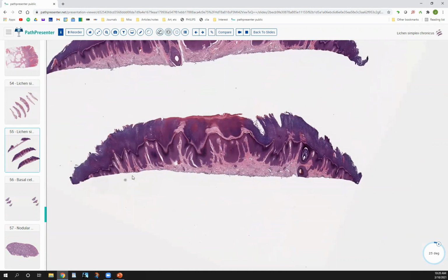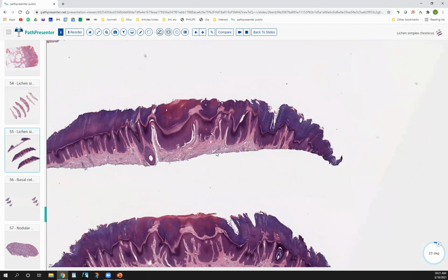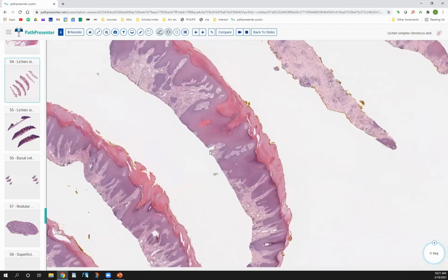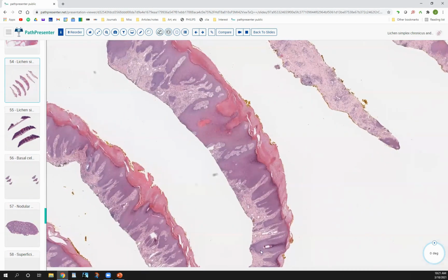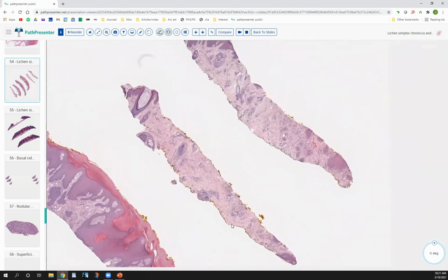It doesn't have that bulldozer effect. I mean, you have thickened epidermis, but it's centered around follicles and it's sort of at one plane. It's not as irregular and as deep as what you were seeing in verrucous carcinoma. Going back to this other one. Same thing sort of here, even though it's cut off at the base, it still doesn't really have that deep extension. I think actually they did a deeper shave right here, which shows that it's not going any deeper. So that helps.